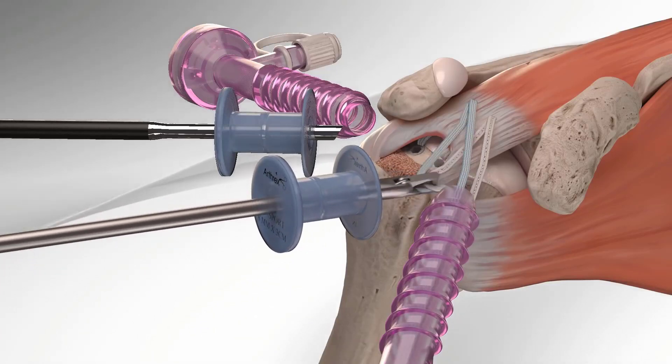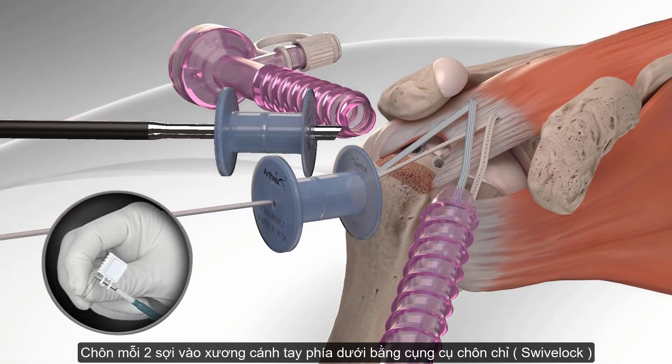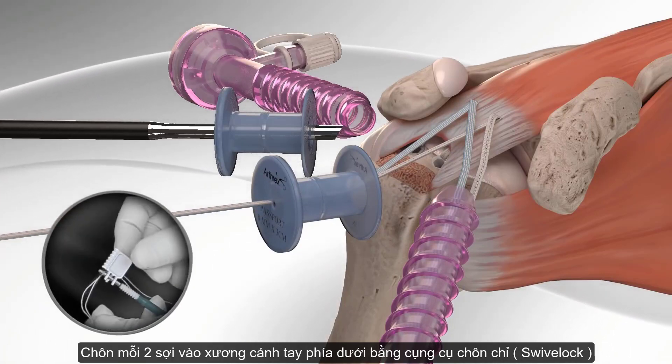The surgeon retrieves one fiber tape tail from each of the anchors and preloads the fiber tape tails into another swivel lock anchor.